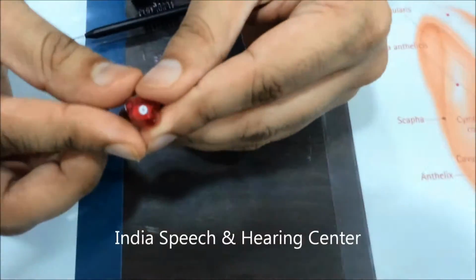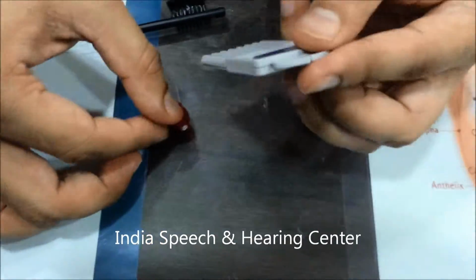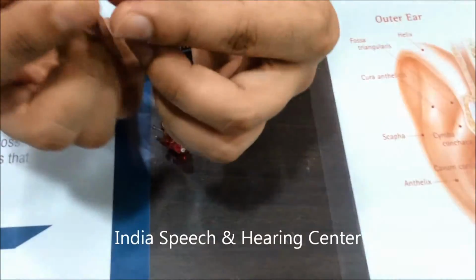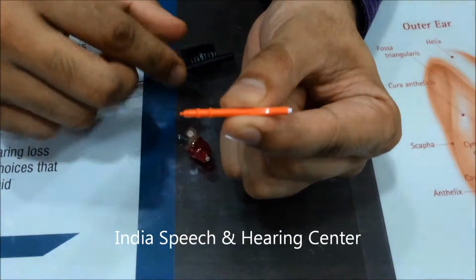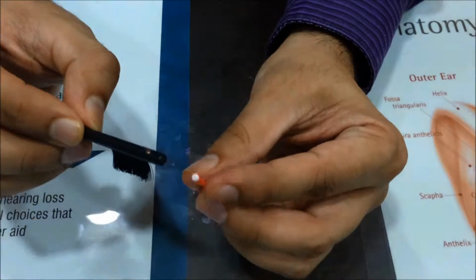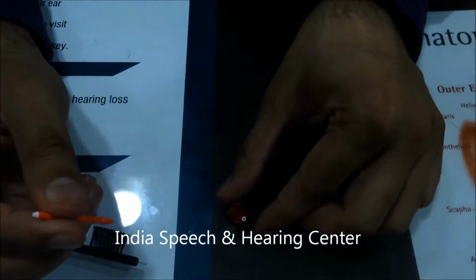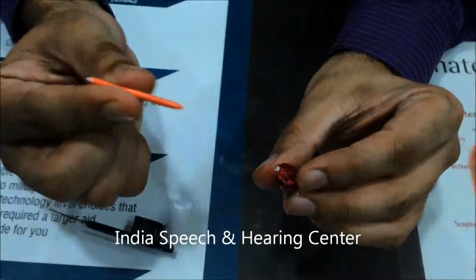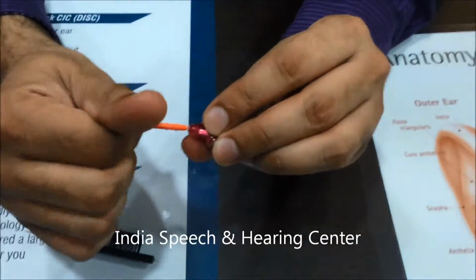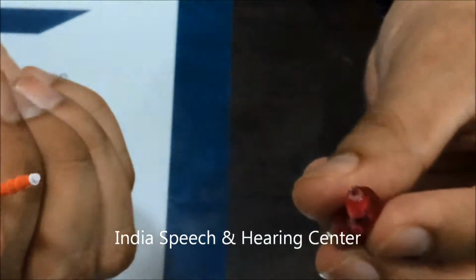Now we will demonstrate how to replace the wax guard. Along with the hearing aid, you always get an addition of wax guard sticks. This stick, if you see, has got two ends. One end is an empty end, the other end has got a small white filter over it. To replace the old wax guard, you have to insert the empty end into the wax guard of the hearing aid, twist till it locks there, and then you have to take it out.